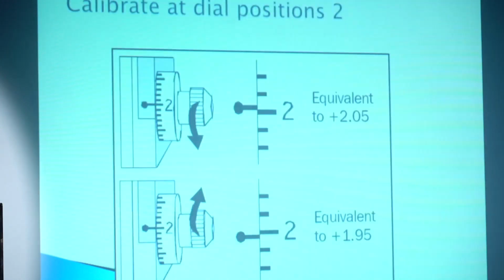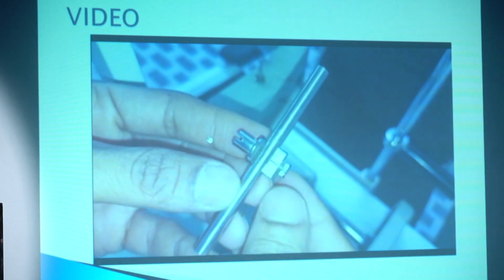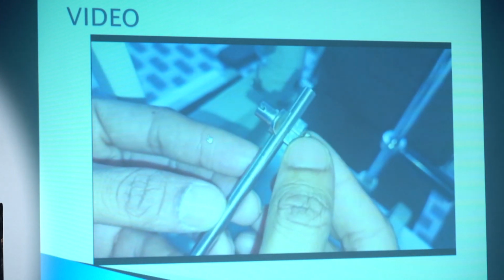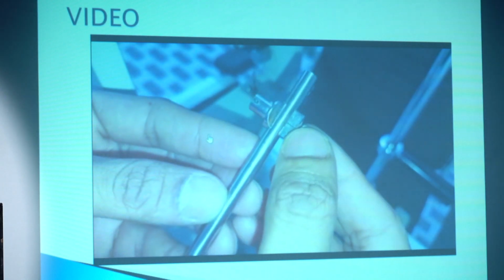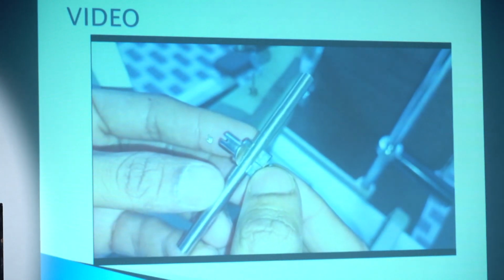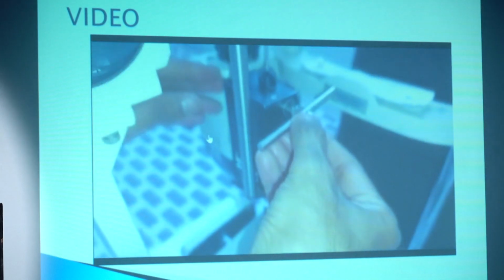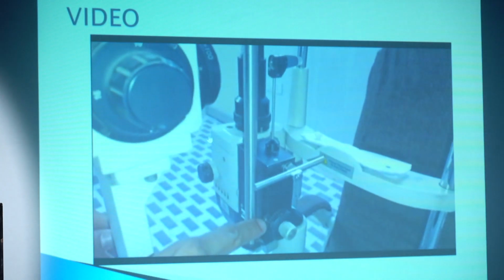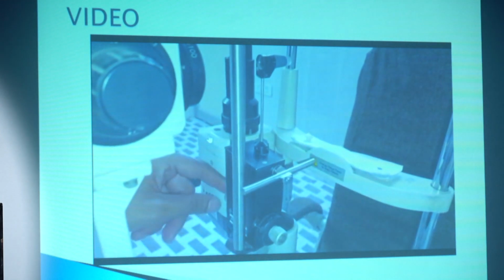So I will again demonstrate through the video. This rod, this center point is 0, then this is 2, meaning 20 millimeters of mercury, and the last, the tip side, is 6, which is 60 millimeters of mercury. Just put this in the 0 position and start calibration, and the knob should also be at 0, and our focus is to see the 0 towards our prism.